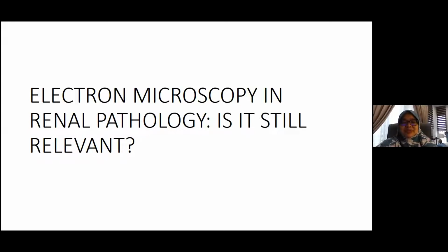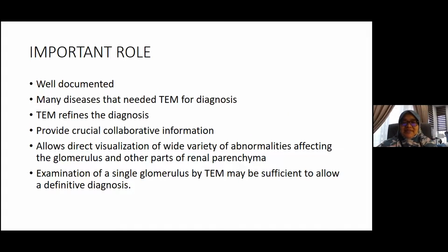Is electron microscopy in renal pathology still relevant? I think I have illustrated in my cases that yes, electron microscopy is still relevant, still important, and sometimes crucial. In some cases, electron microscopy will just support the diagnosis made by light microscopy, immunofluorescence and other immunohistochemical staining. But for some diagnoses it is crucial for pinpointing a particular diagnosis.